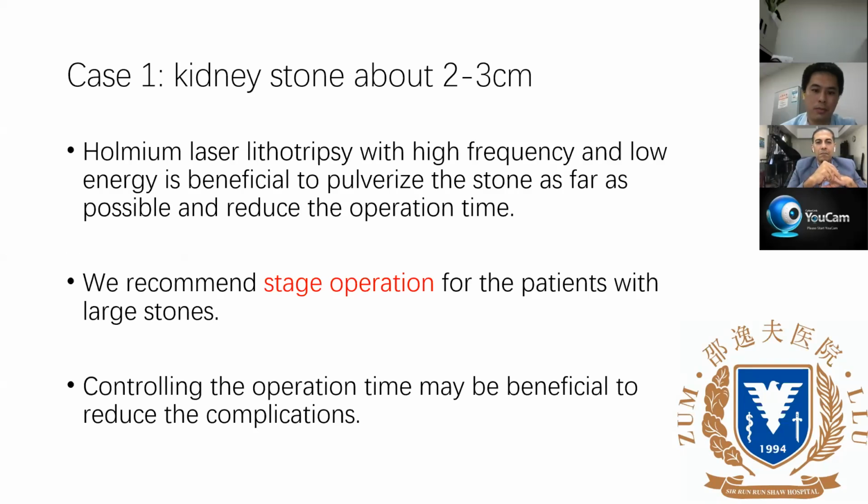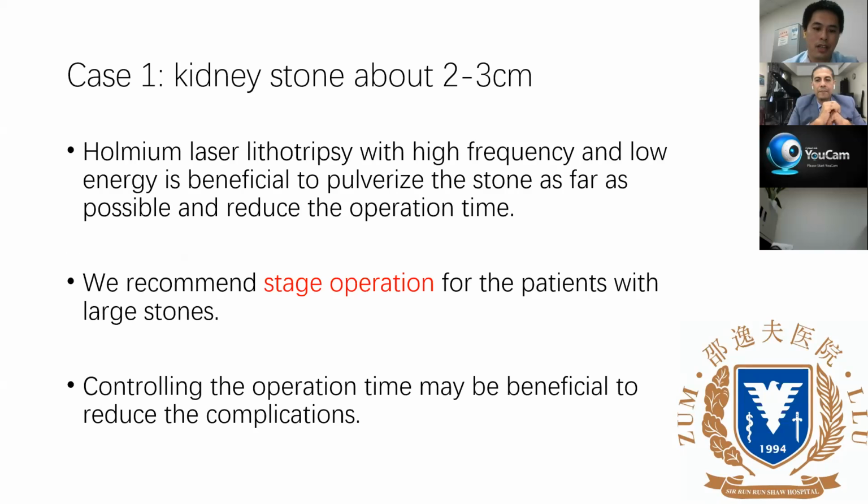And we also recommend staged operations for patients with larger stones. If the stone is bigger, we think 2 or even 3 procedures is acceptable. And controlling the operation time may be beneficial to reduce the complications.